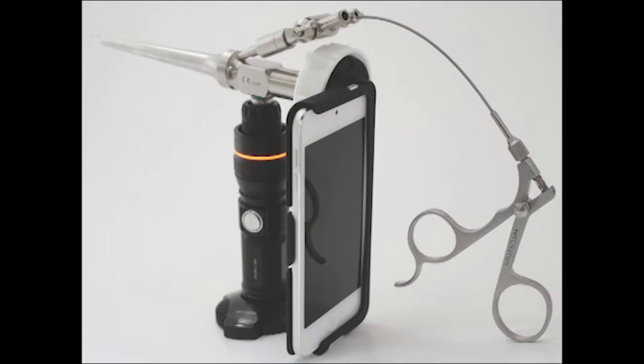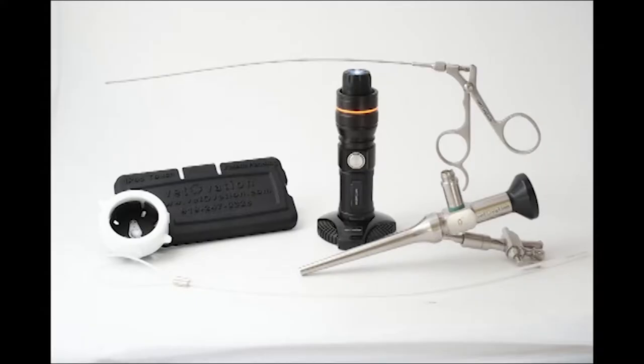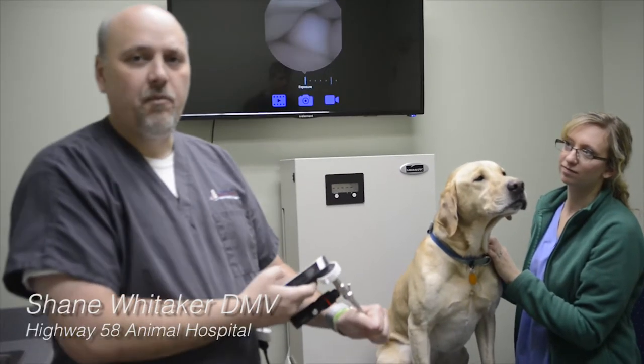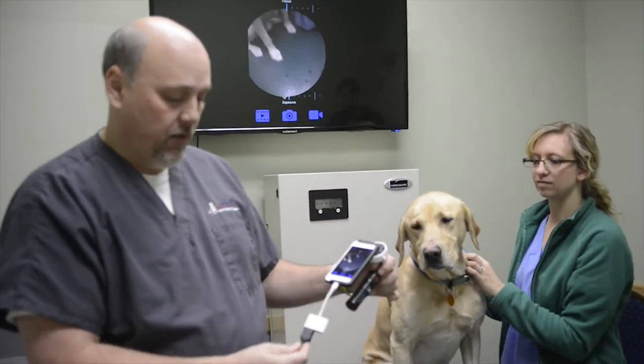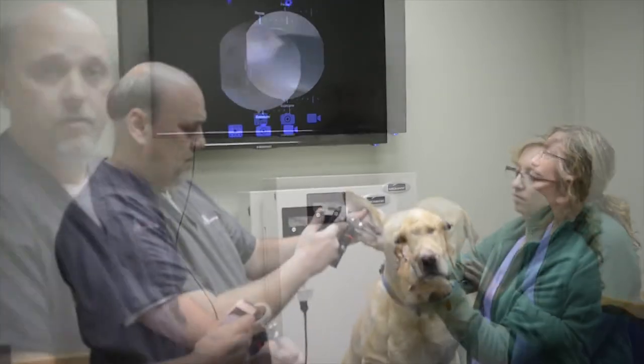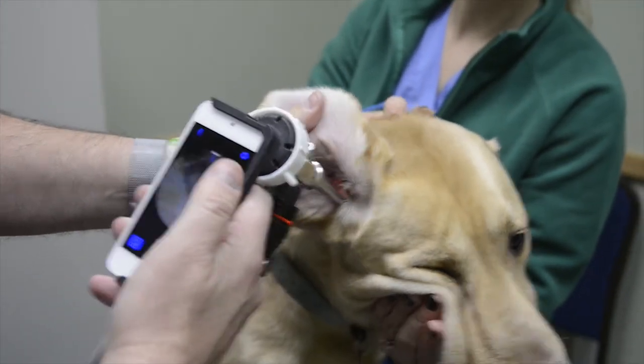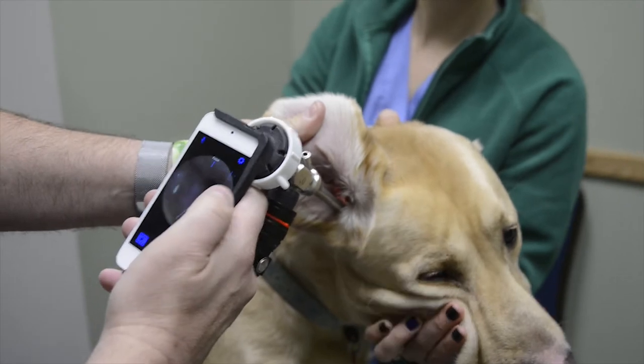The Video Scope is a simple-to-use system that attaches a scope to your iPhone or iPod Touch for otoscopy, rhinoscopy, and rabbit intubation. The scope magnifies the image times 30 and has a working channel to take a biopsy or remove debris. You already know how to take pictures and video with a smartphone. The images can be shared with a TV via an HDMI cable. This is a great way to share images with a client during an annual exam.